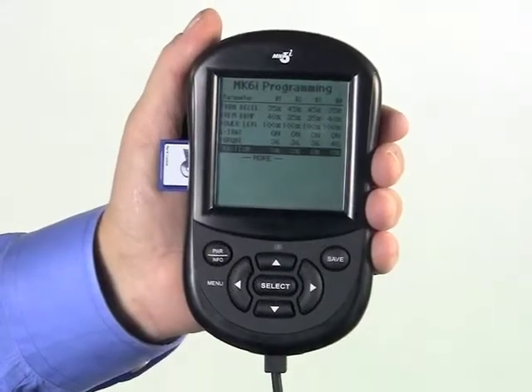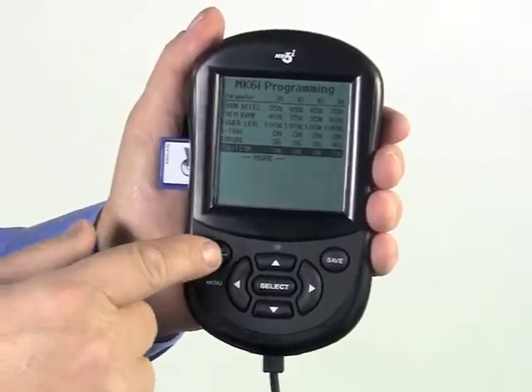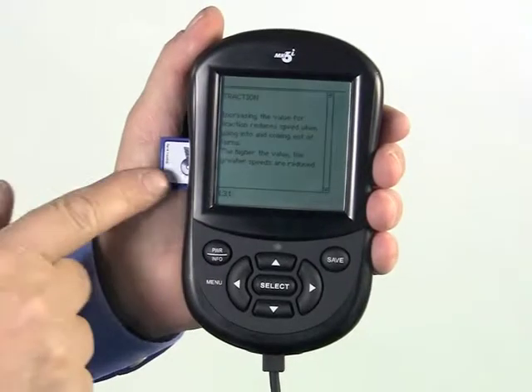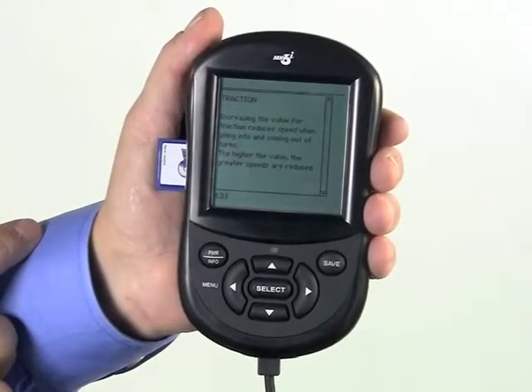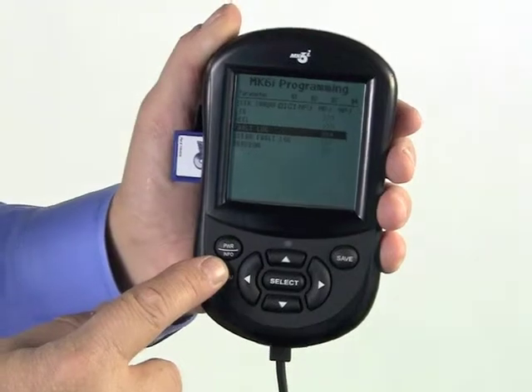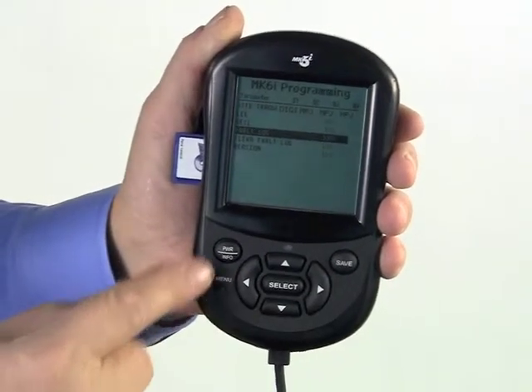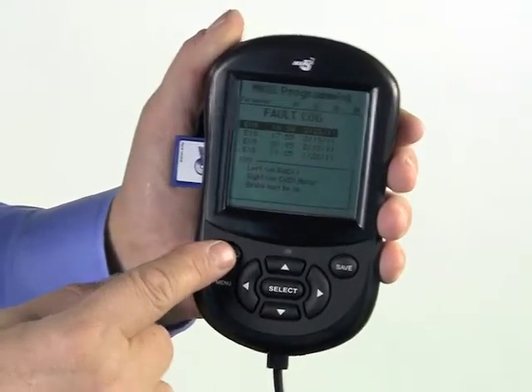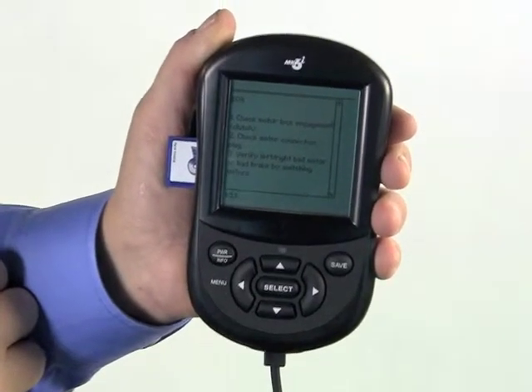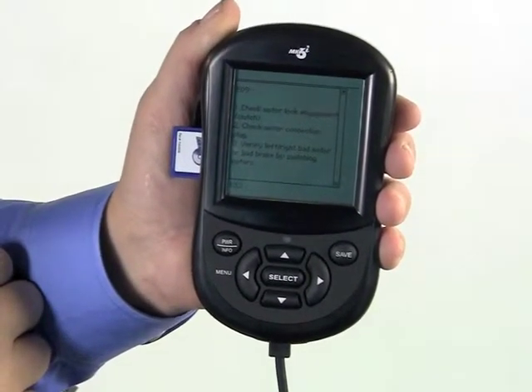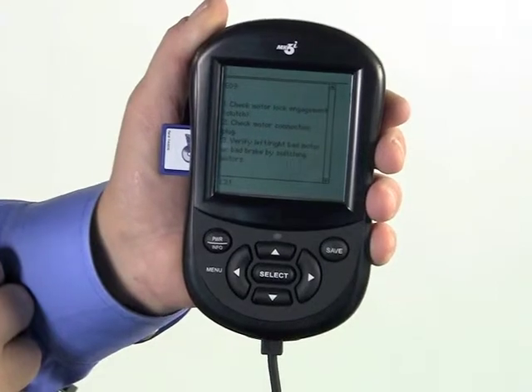The help key displays definitions for highlighted parameters and values, but only when a professional SD card is inserted into the programmer. The help key will not only show definitions of individual parameters, but also show the necessary steps needed to resolve error codes that may appear. This will be covered in more detail in a video showing use of the SD card.